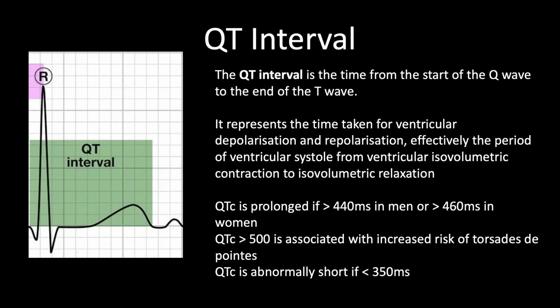I'm not going to dwell much more on the QT interval and why it's important, and some of this we'll probably touch on a little bit next week, but just be aware the QT interval is really important, and if you can practice calculating it, that would be great.